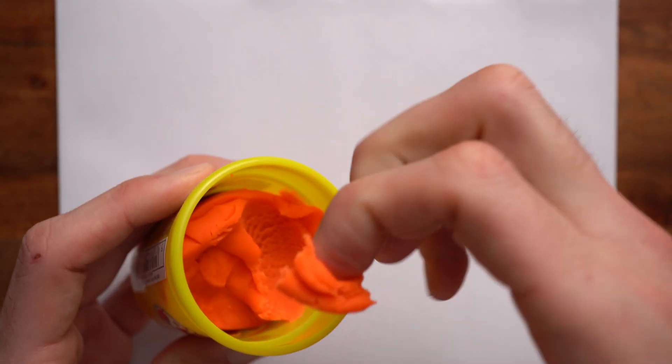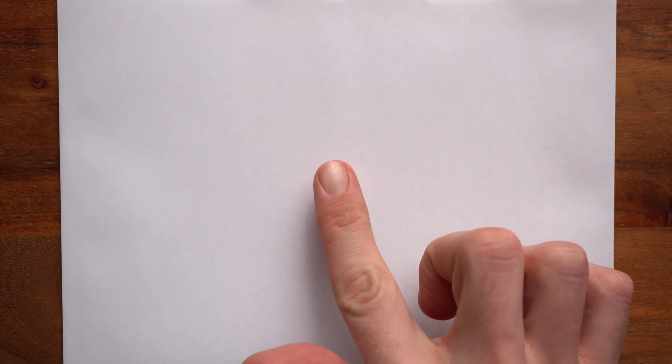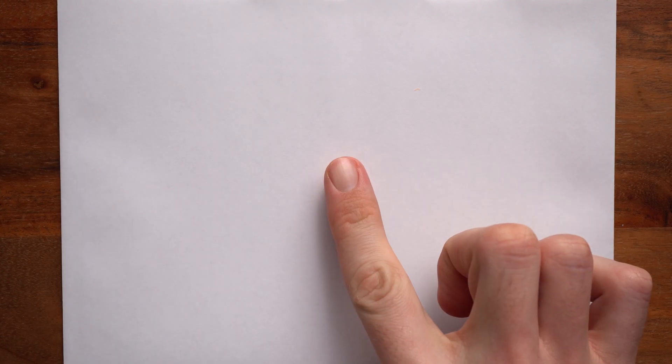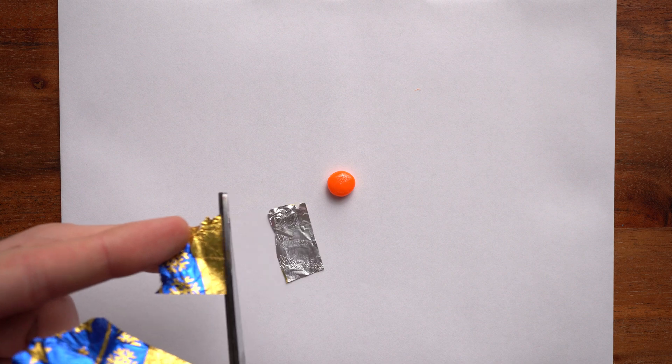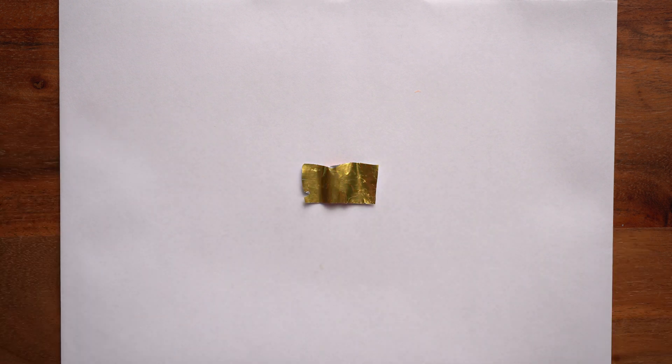Step three: take your first color of Play-Doh and roll it up into a little ball with your fingers. Put it on a piece of paper and gently press it down. This will be your fake lens. If you don't want the tinfoil to stick to the lens, put some oil on your finger and gently dab the lens. Step four: cut out a piece of the tinfoil. Remove all the wrinkles and then gently put it on top of the lens.